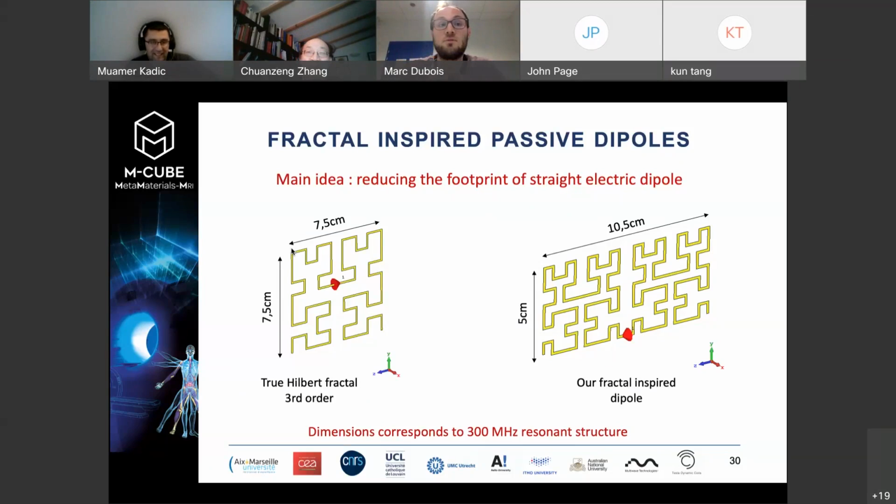Then the only moment where in MRI you can have multiple frequencies is if you use other nuclei. So not only the hydrogen or proton nuclei is used in MRI, actually people use a lot of sodium, carbon, and phosphorus imaging. But the problem is you don't usually get nice images because they are much less present than water in the body. So what you would do is kind of spectroscopy, and you compare how much you have, some peaks, and the height of the peak is the amount of sodium you have in the body.